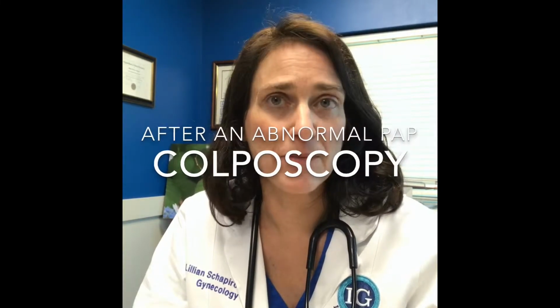This is Dr. Lillian Schapiro, and I am here to talk to you today about a colposcopy. A colposcopy is the next step in diagnosis when you have an abnormal pap smear. So what are you coming back for when you're coming back for a colposcopy?